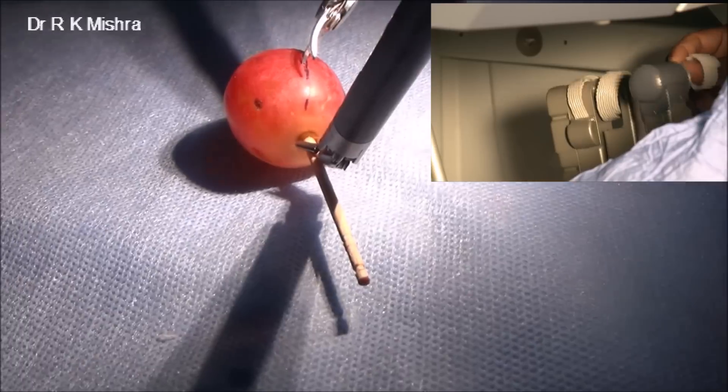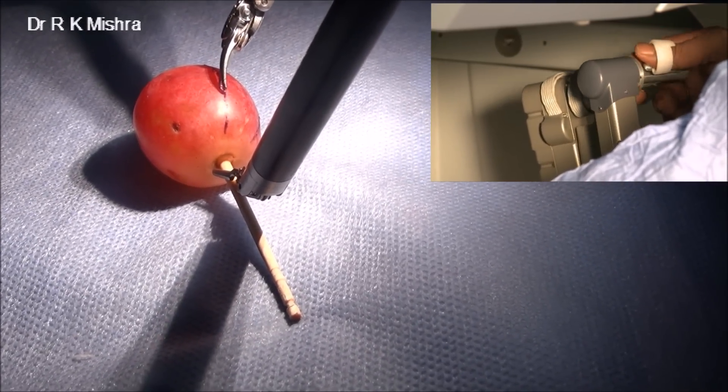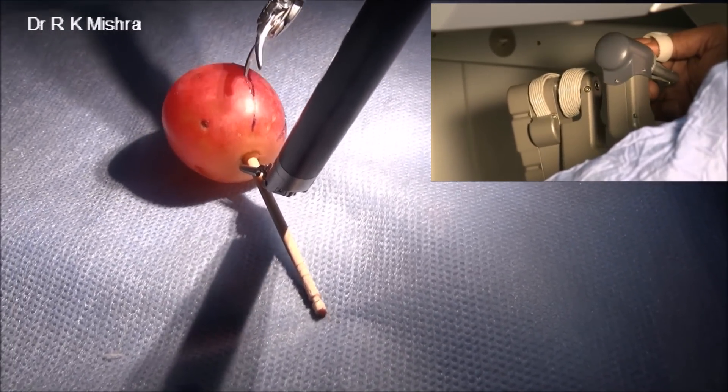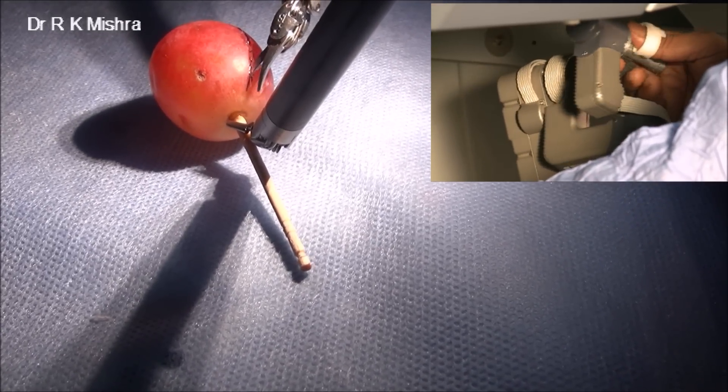And that will reflect on your surgery on humans as well. For example, if you want to do pyeloplasty, recanalization, or ureterocystostomy anastomosis, then this precision will help you there. We can see here that very precisely the micro scissors is cutting the skin of the grape, and the micro needle holder is stabilizing it. And now it is complete.